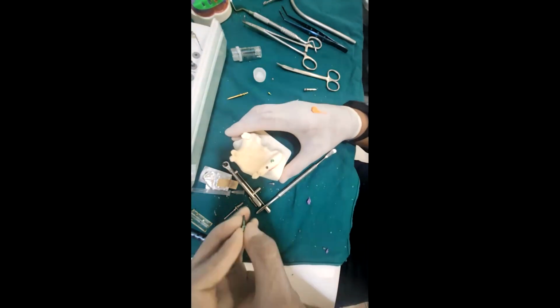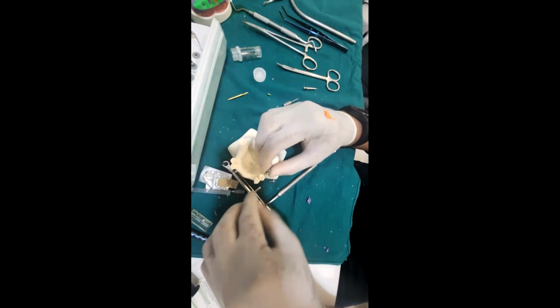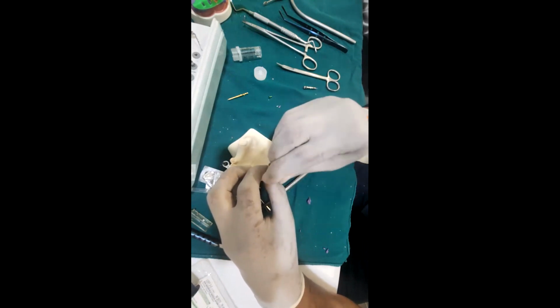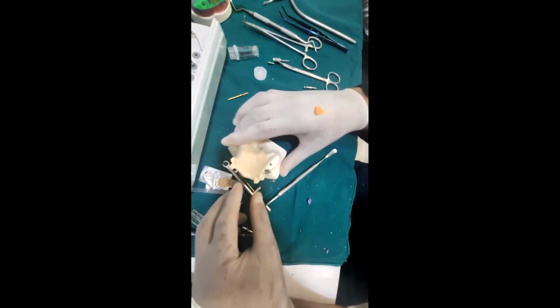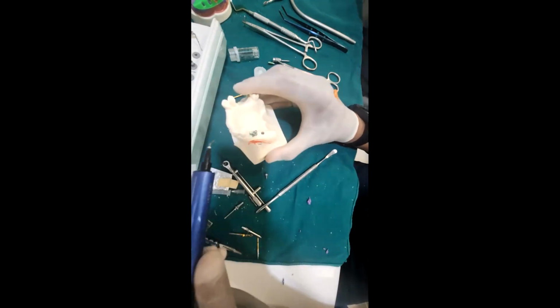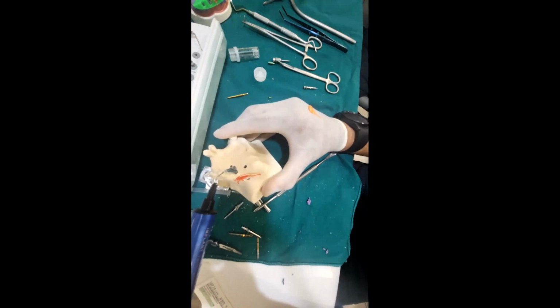I have another model where we had practiced sinus surgery. So you have to use some floss thread or you apply bond and you are supposed to put the light.